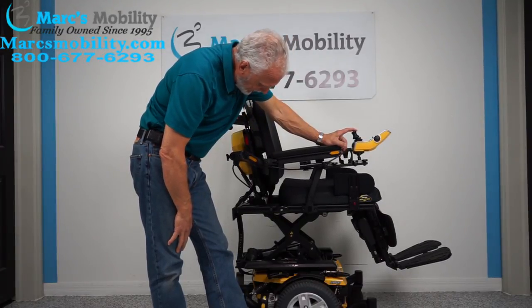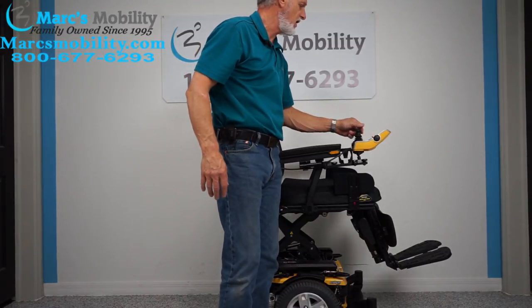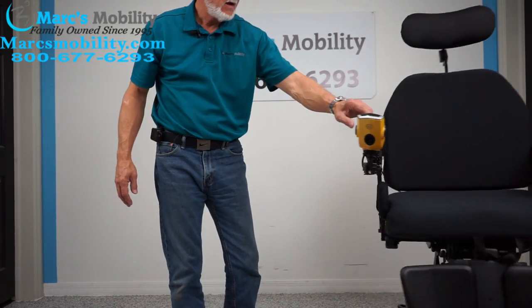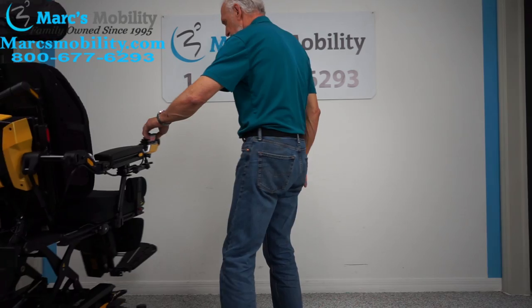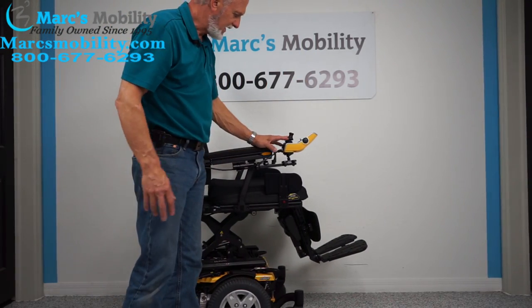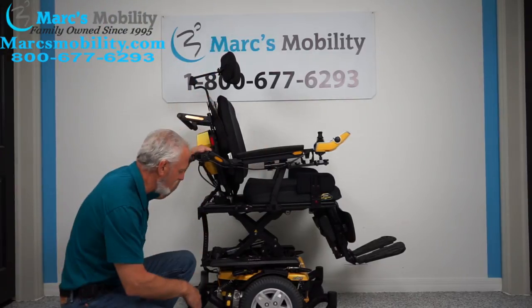There goes the seat lift all the way to the top. The nice thing about this chair is that when the seat lift is elevated all the way to the top, you can still drive this chair at a decent speed. Now I don't recommend you drive this chair with the seat elevated outside, especially if you're not on a flat surface — that would be asking for trouble. It's good to make the seat go up and down, but just be careful.